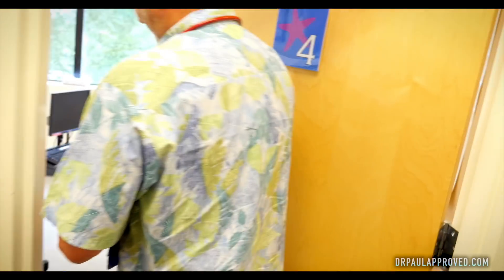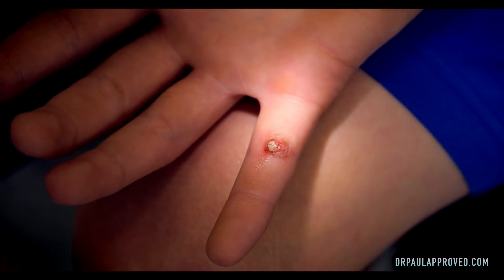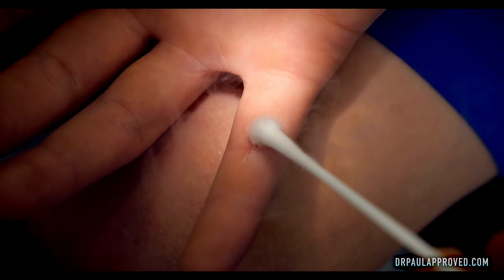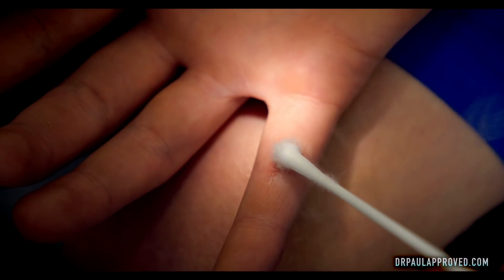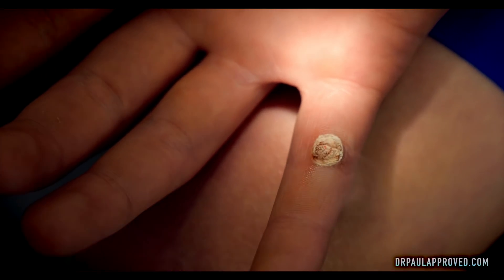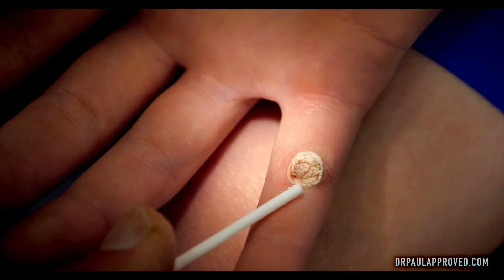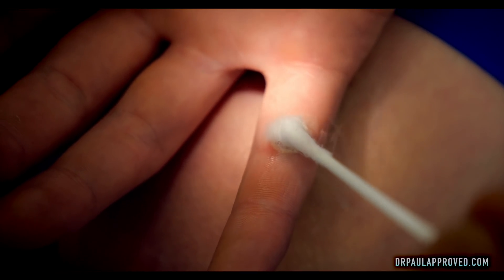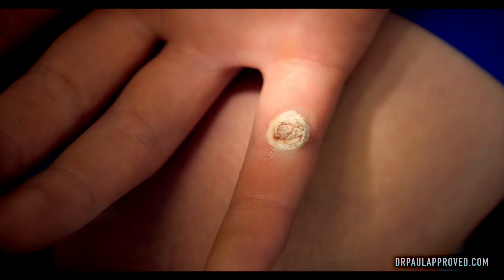Freeze. Sorry about the wait. Freeze. This hurt yet? Mm-hmm. A little? A little. It's a fairly big wart. What we want to do is freeze the entire wart in about a millimeter of normal tissue. You can start to see we're close to a millimeter of normal tissue frozen. And that usually means that we've frozen through to the depth of the wart. Since you've done this three or four times at home, I'm gonna give you an extra half a millimeter of pain.